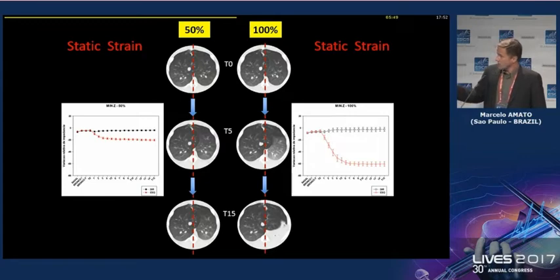This occlusion caused complete blockage of the ventilation in the lower lobe, but at 50%, nitrogen stabilized the alveoli. When we use 100% oxygen, there was complete reabsorption atelectasis, which you can see here. After the occlusion, you see a decrease in the size of the left lobe, which we don't see at 50%.